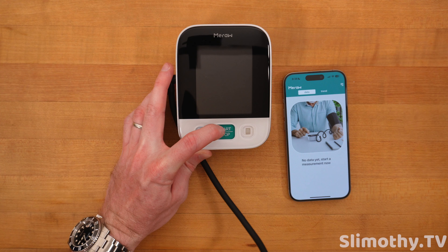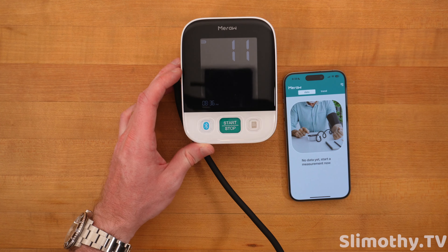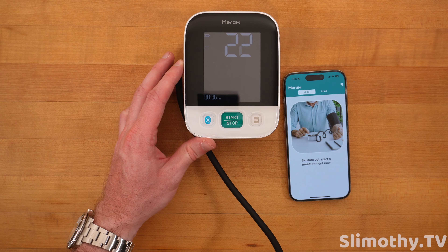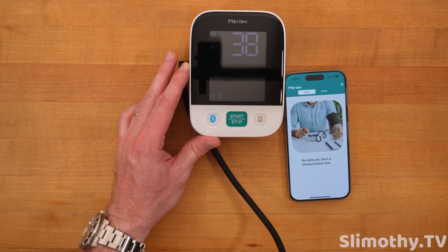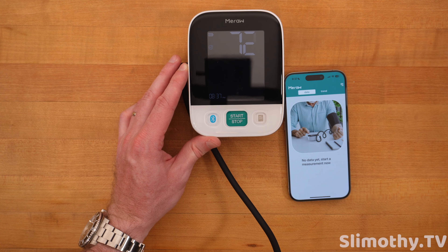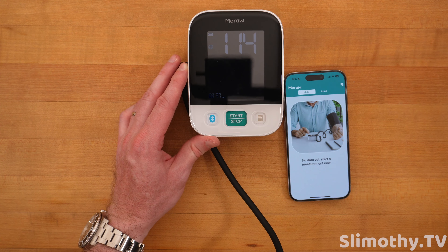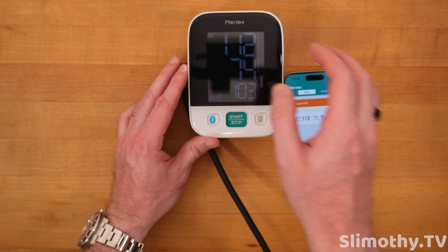Let's plug it in and give it a try. I have the cuff on my arm and it is going up. Now I'm standing, which you're not supposed to do, so I'll be retesting off camera. It's getting tighter and tighter — wow, that's getting tight. The reading comes back at 112 over 74 with a pulse of 103.